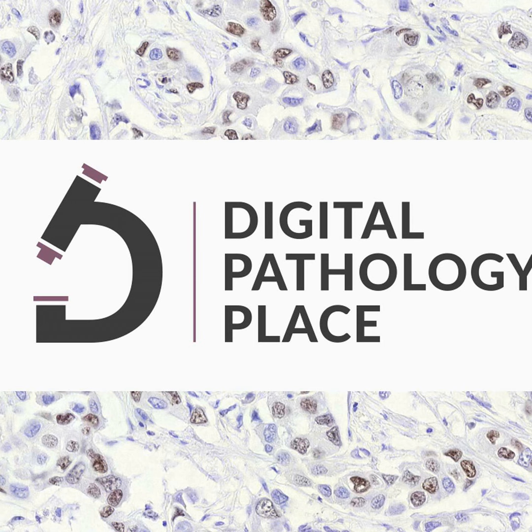Because I know from experience that the FDA usually looks into whether you're using a device for your endpoint measurements, or a variable that you build your statistics and analysis on. Then you want to have that device validated, so that it is regarded as giving the correct endpoints or measurements. So it is easier and more efficient for a drug company, or for whomever is going to submit the file, that the device has already been cleared or approved.